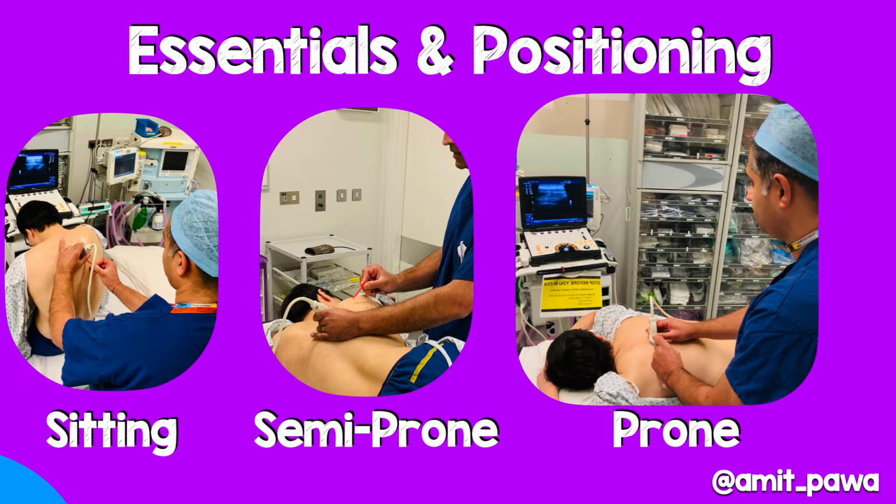However, sometimes trying to explain to the patient how to lie on their side and then flop over became a little bit difficult. So now, most of the time, when I'm performing the block, I get the patients fully prone. And the advantage of doing that with patients before they go off to sleep is it's easy to get them to lay on their front. They're then nice and stable. You can use a decent amount of sedation, get them comfortable, and everything is nice and stable.